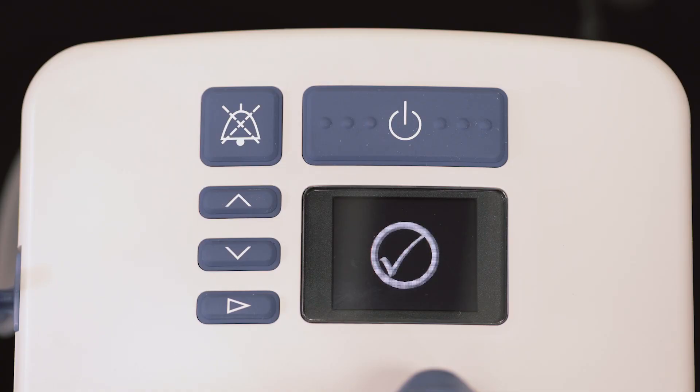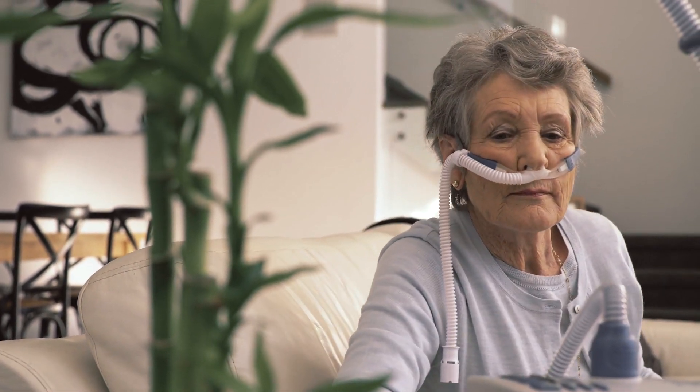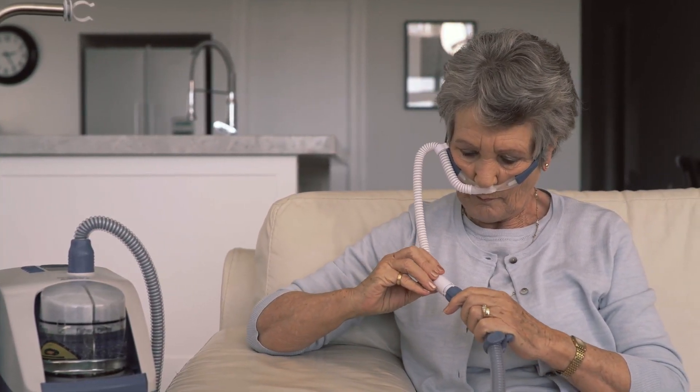When the ready-for-use symbol appears on the display, connect the patient interface to the heated breathing tube. Attach the interface to the breathing tube by simply pushing the two connectors together until you hear a click.